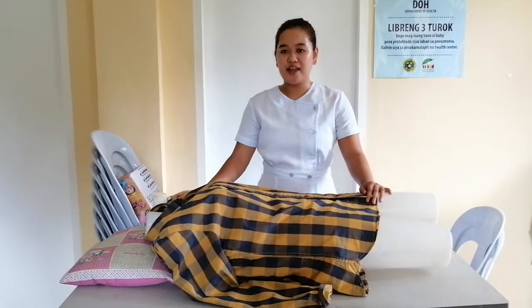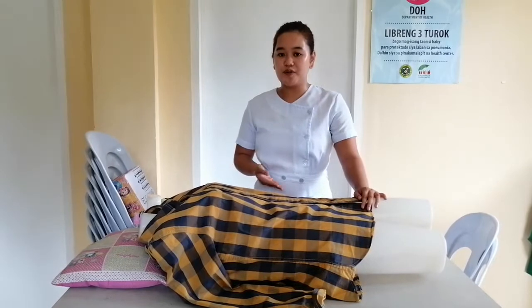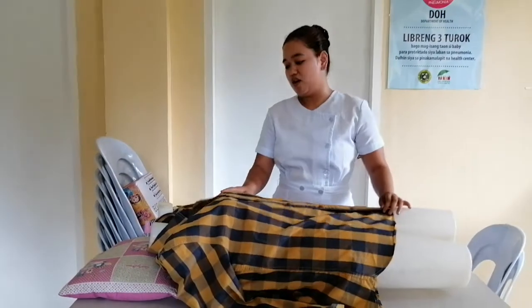Good afternoon, everyone. I am here to demonstrate the ECG, or electrocardiogram, with the 12 leads to be placed on the client's chest. What's the purpose of doing this demonstration? The ECG is performed on a client because the patient's heart needs to be examined. The electroconductivity of the heart also needs to be assessed.